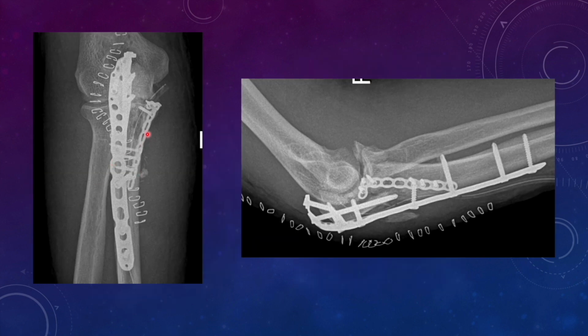So you see it has been buttressed with this plate, and additional stability has been provided by screws which are close to subchondral bone. So this part is actually the sublime tubercle when seen from the lateral side, in the lateral view, and this is shown here in the AP view. So you see the articulation is now looking good along with the medial part of the trochlea, and the olecranon plate is going to address the olecranon chunk, and it will keep it in line with the remaining part of the ulna.